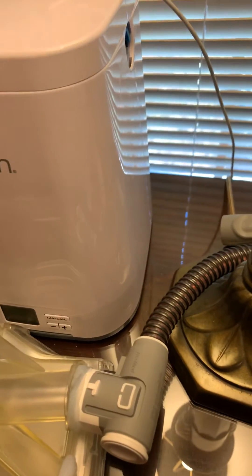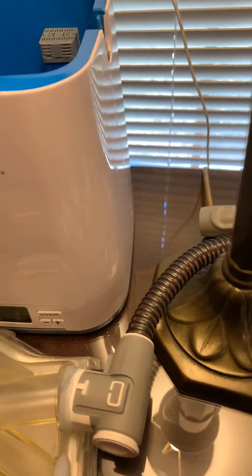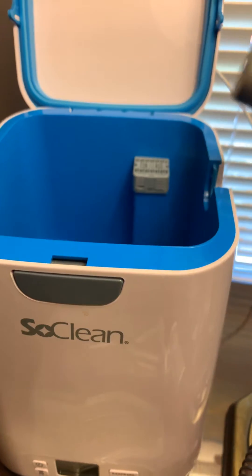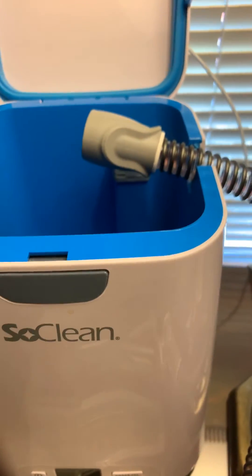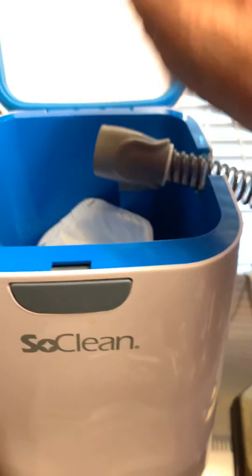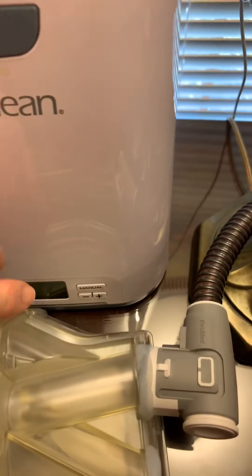Then, after we've done that, we can just connect up the hose into the CPAP, and then we can drop in the mask and close it.